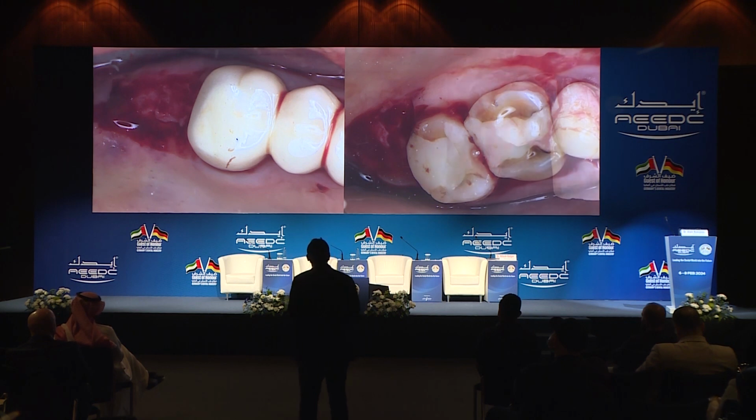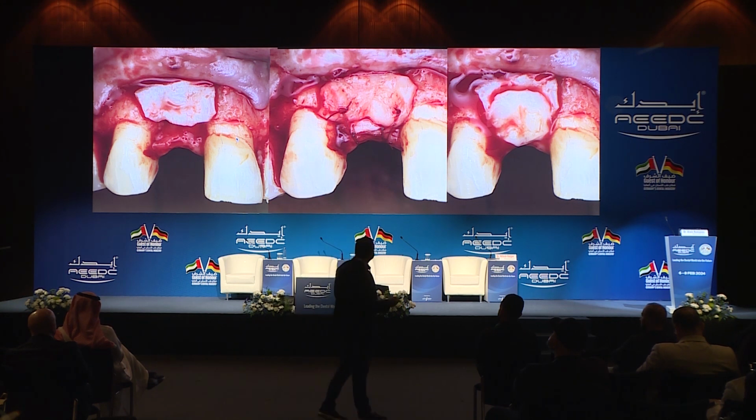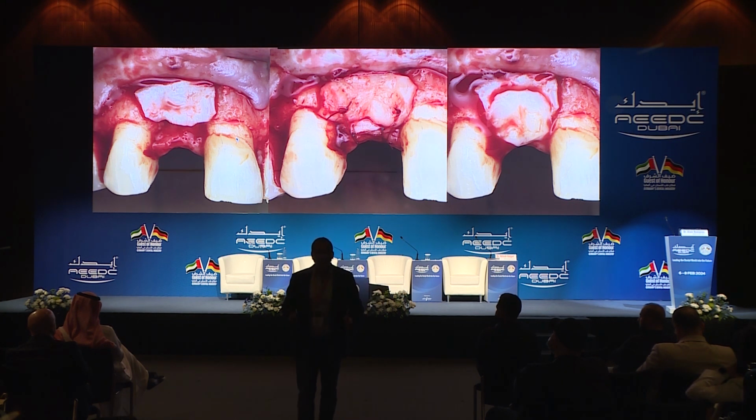And then I took them both and tried to do a double graft, like a buccal graft and a palatal and papilla graft, which is really not easy. It's a very challenging procedure, I can tell you. And if I tell you it's predictable, it's not. I promise you, it's not.